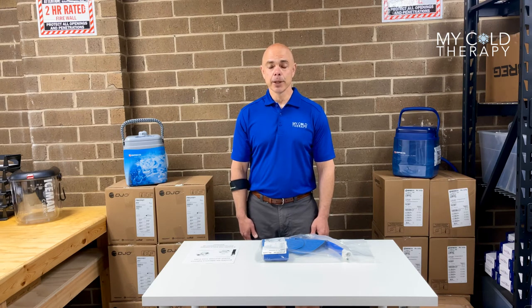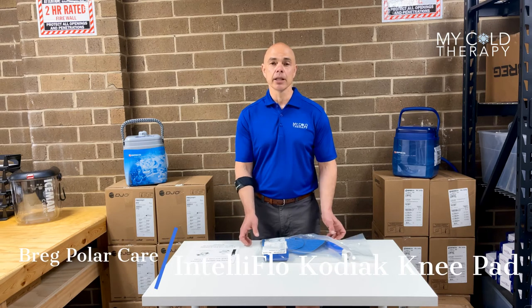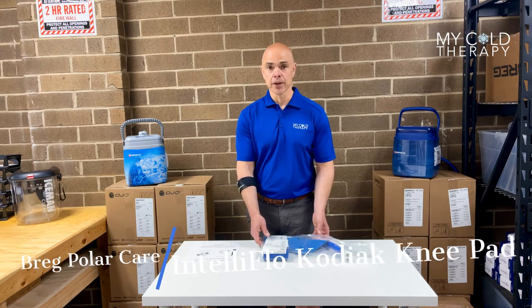Hi, my name is Steve from My Cold Therapy, and welcome to our continuing series today on the Intelflow Kodiak Bragg pads. Today we're going to be talking about the knee pad with compression.